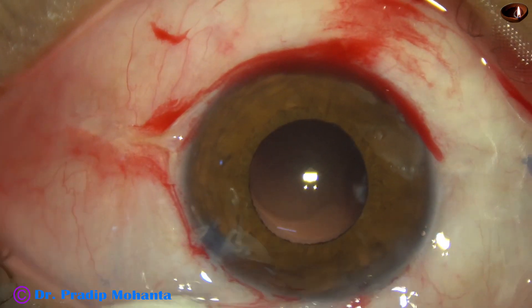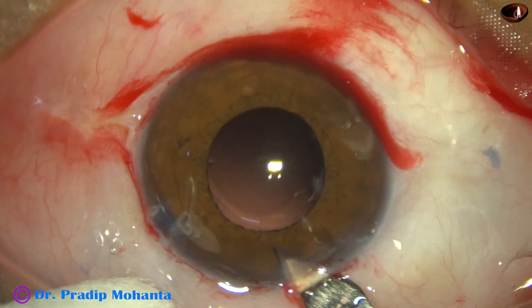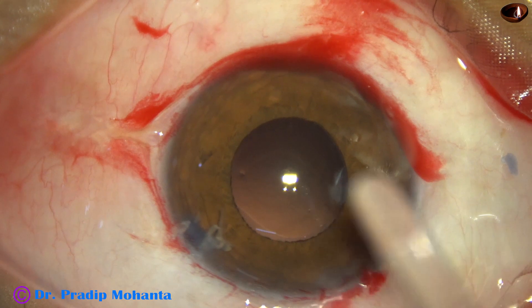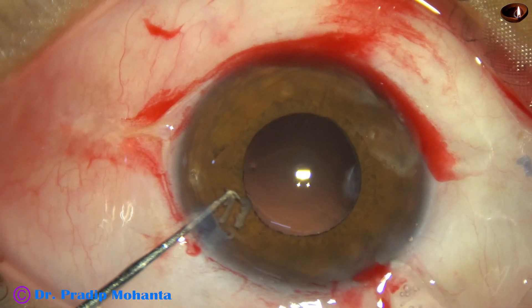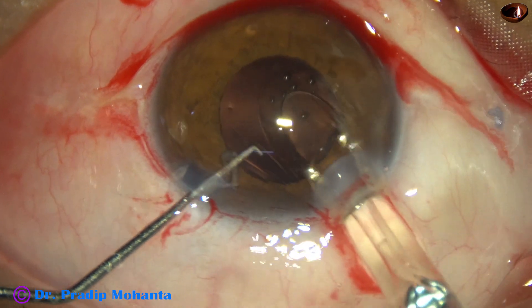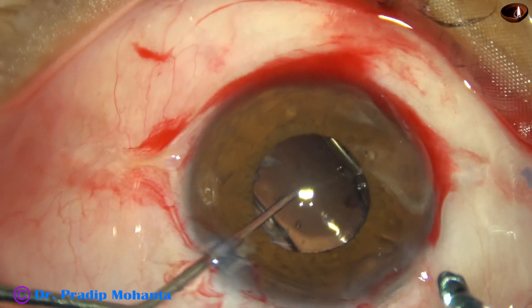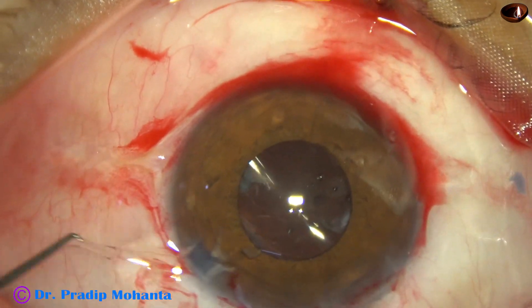Enlarge the main wound. My first plan is to implant the intraocular lens and then aspirate the cortex. So here goes the intraocular lens — this is a single piece, monofocal, hydrophobic, acrylic intraocular lens. The leading flange goes into the capsular bag and the trailing flange also goes into the capsular bag. So very nicely the lens is placed in the bag.